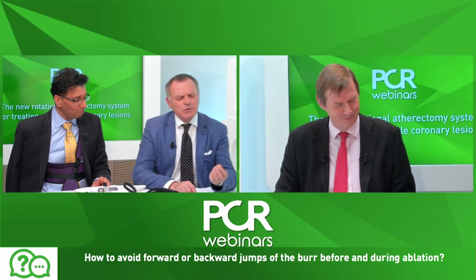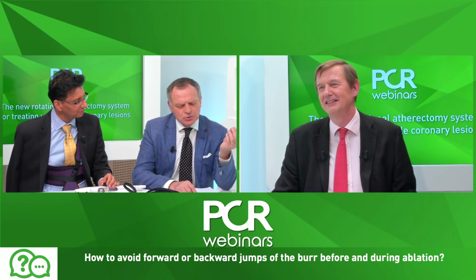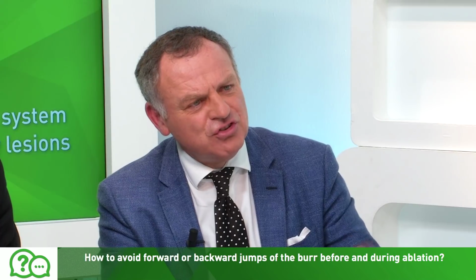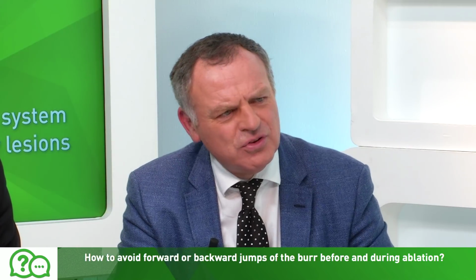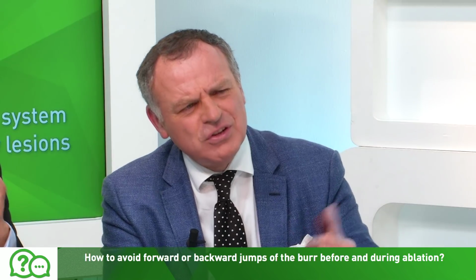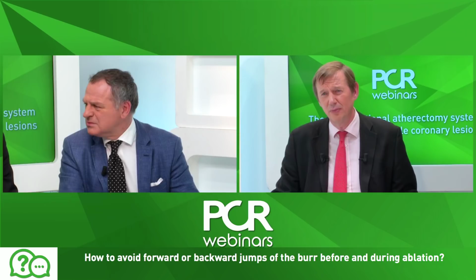Bruno? Well, sometimes it happens at the moment when you just exit the guiding catheter. So you sometimes have to modify the position of the guiding a little bit to release the tension on the burr. I think that's the key point. When you want to release the tension, it's just after the exit of the guiding. And on the manifold itself, I think there's a little tip which is quite useful.